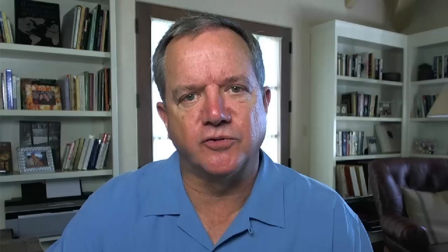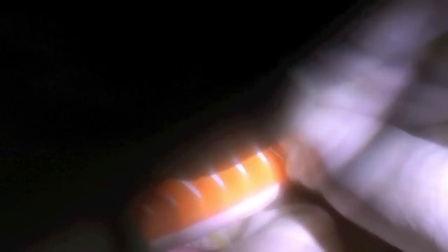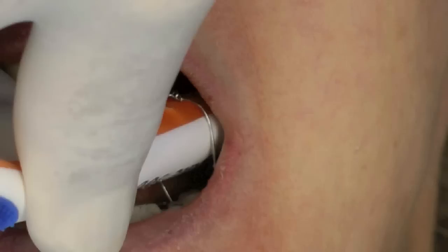We'll thread the orthodontic wire again through the contacts and then put our large toothbrush in place. Using hemostats, we'll wrap a tight loop so that it's connected very well to the end of that toothbrush. Now we use the same concept — we come in with our fulcrum and push down in the front, which is pulling straight along the path of insertion in the posterior. The trouble typically is when you grab these restorations and twist, all you're doing is binding them on themselves. With the wire, the wire doesn't break. It takes a fair amount of force, but sure enough, they pop off.